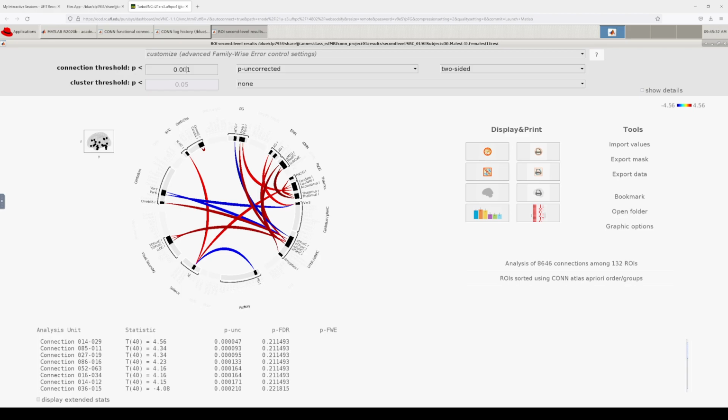And meaning that given our small sample size, which isn't great for a lot of reasons, we don't want to have too many false negatives. We don't want false positives, but again, there's going to be a balance, and this can be one way to potentially balance that. If you had more of an exploratory sample, this preliminary data or pilot data, we could show there might be stronger functional connectivity in females than males. Whether or not that's good or bad, we don't know. Really probably can't even label it as good or bad.